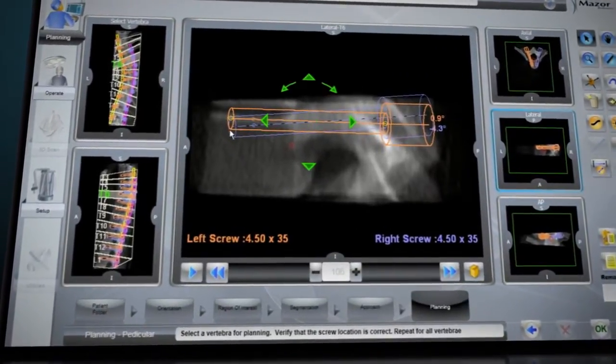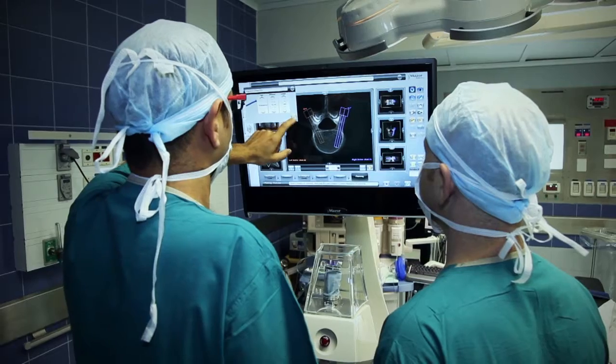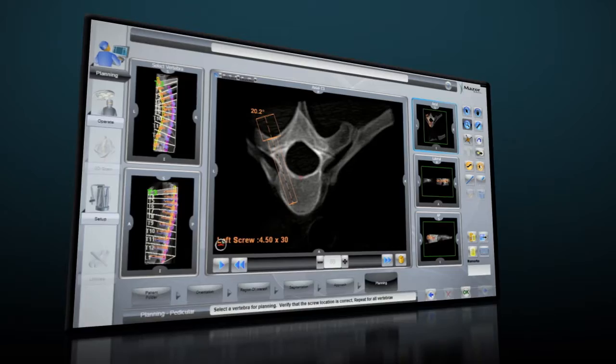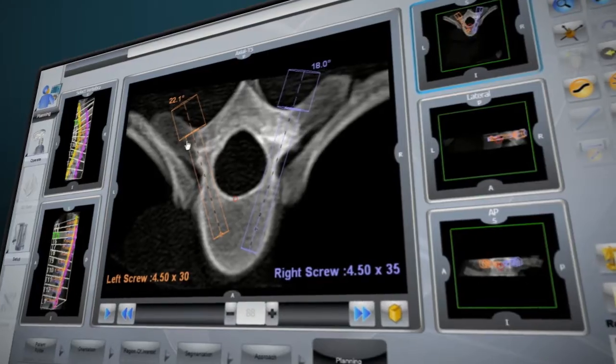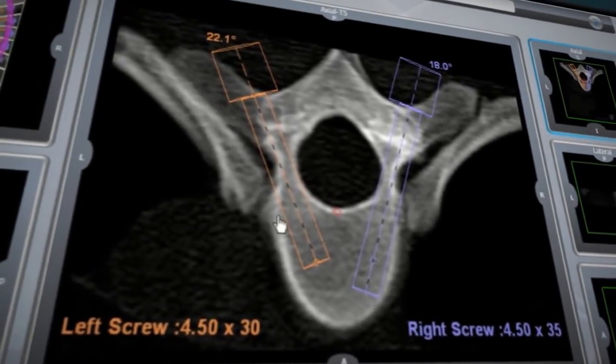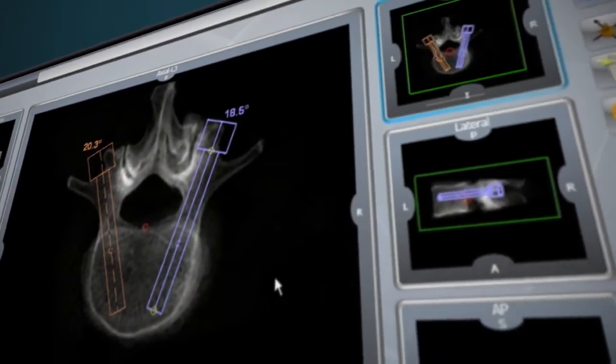Renaissance preoperative planning provides many advantages with better preparation for each surgery. Anatomical challenges such as hypoplastic pedicles are identified. Trajectories such as in-out-in can be planned, and implant sizes are optimized for better bone purchase and strategic placement.